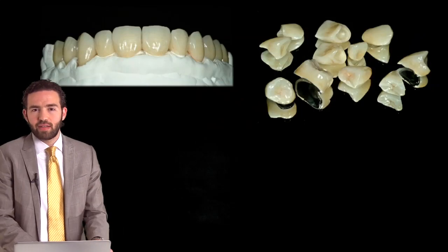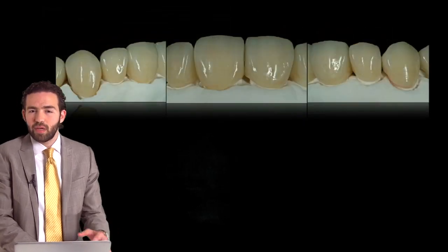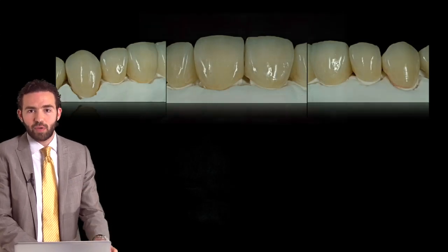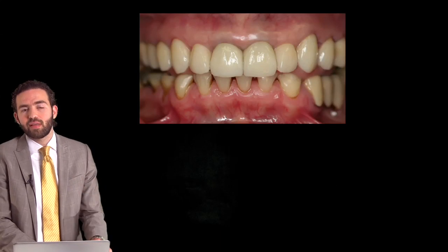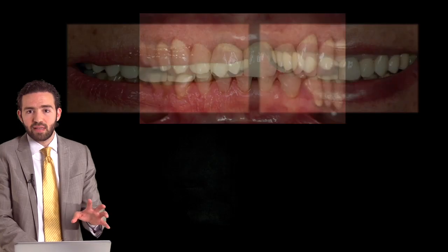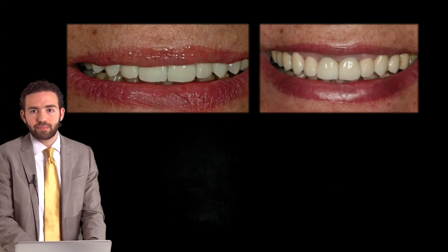It was in the very early stages of zirconia, and everything looks nice on the casts, because the casts are white and we really cannot see the influence of the discolored abutments. But once we put them in the patient's mouth, unfortunately the discolored abutments really show through these zirconia-based restorations. You see the two central incisors are more grayish, and if you remember from the previous slide, after we prepared the teeth, the two centrals are actually highly discolored.